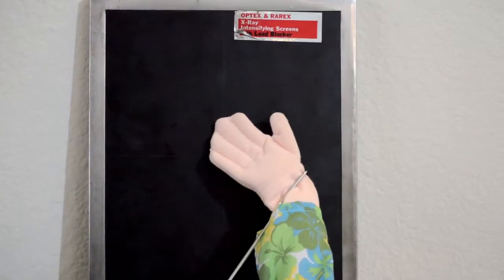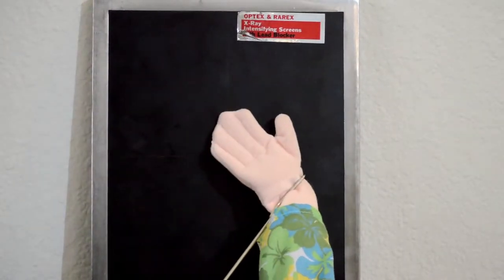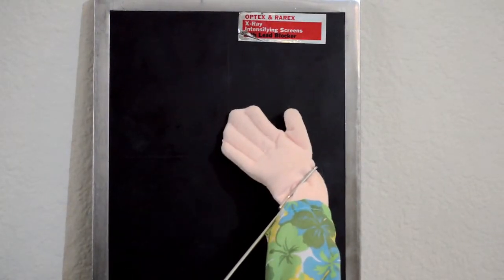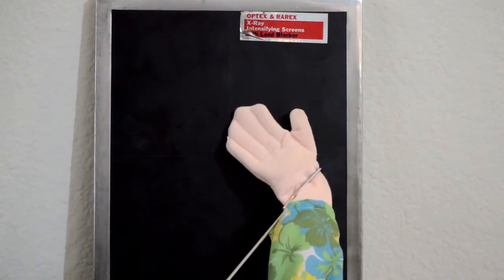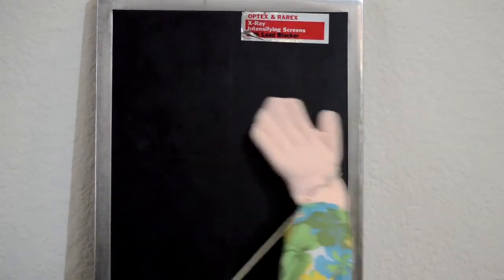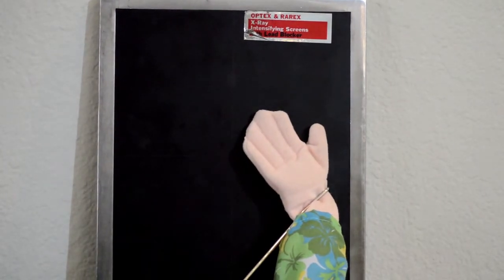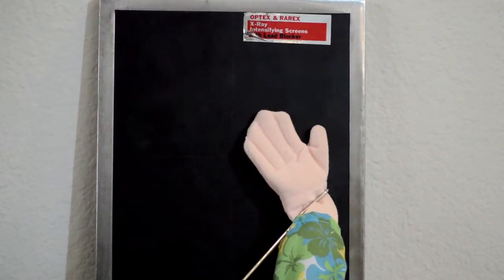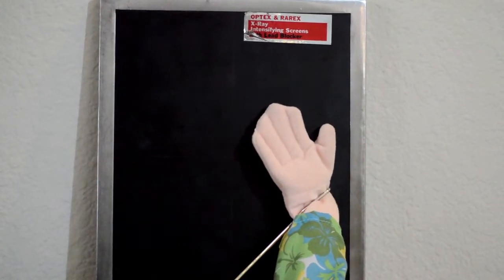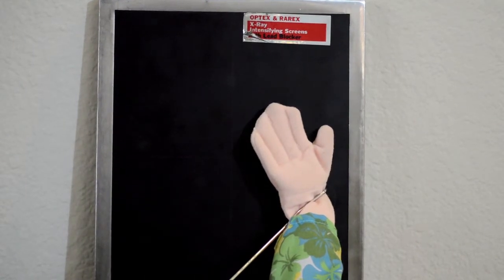This is a cassette. It is used to protect film from being exposed to light, as well as from bending or scratching. It also contains an intensifying screen, and the film is kept in close contact with the screen during the process. The X-rays can easily penetrate the front of the cassette, which allows the X-rays to interact with the phosphors in the screen. This interaction causes the phosphors to glow, which is what the film is exposed to. Because film is more sensitive to light than to X-rays, you can use a lower radiation dose and let the phosphors do the work of exposing the film to the image.